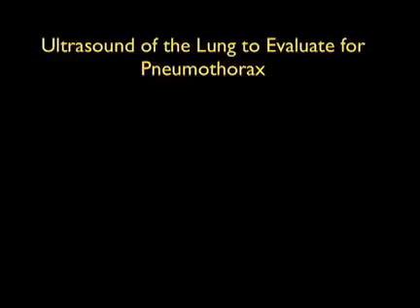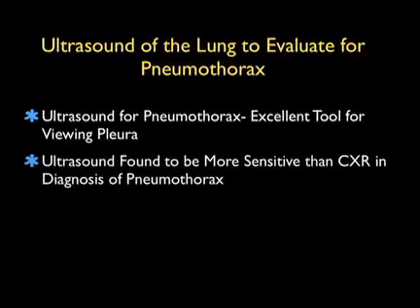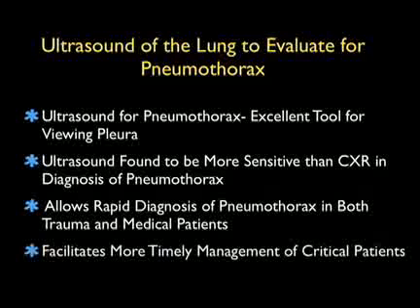In conclusion, I'm glad I could share with you this ultrasound module going over ultrasound of the lung to evaluate for pneumothorax. This is an excellent tool for viewing the pleura and making the diagnosis of pneumothorax, and there's been some research showing that it may be more sensitive than chest x-ray in the diagnosis of pneumothorax, allowing rapid diagnosis of pneumothorax in both your trauma and medical patients, thus facilitating more timely management of these most critical patients.